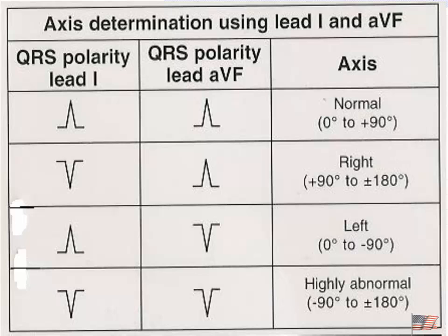Under normal conditions, both lead 1 and lead AVF would be positive QRS complex. When I say positive, I mean that this is bigger in size than this. So there's more positivity than there is negativity as far as that isoelectric line. Am I okay there?